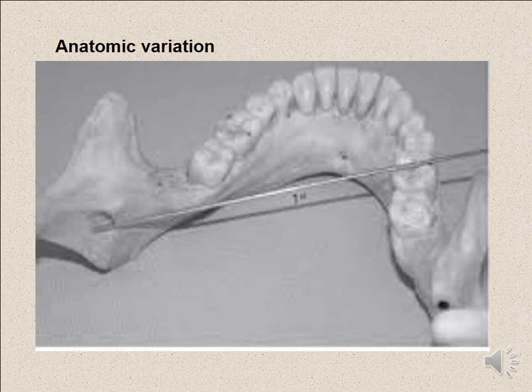This shows the bone of the mandible, and how to insert the needle along this straight line to above the mandibular foramen, above the lingula.